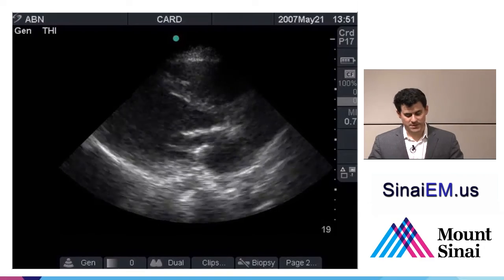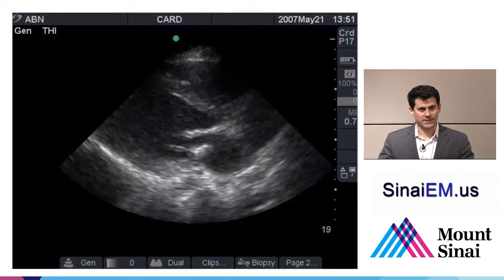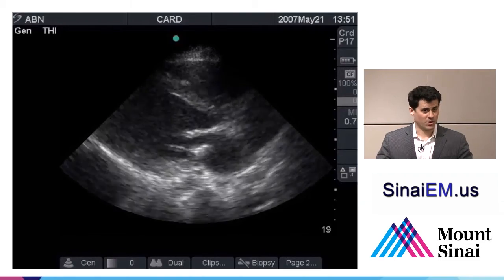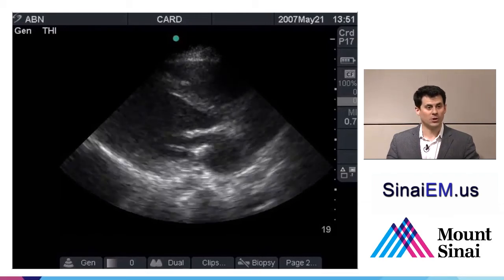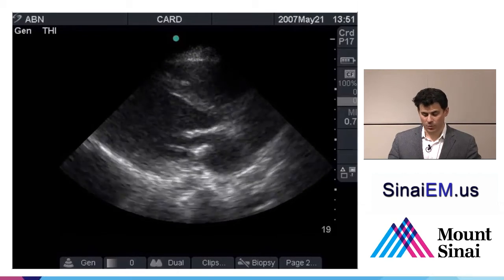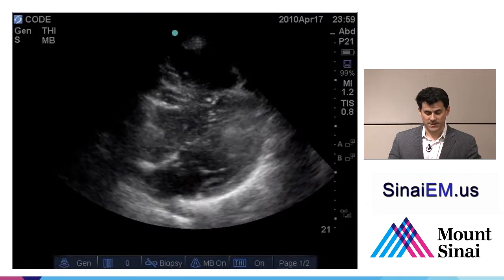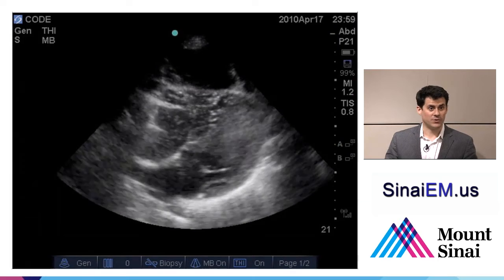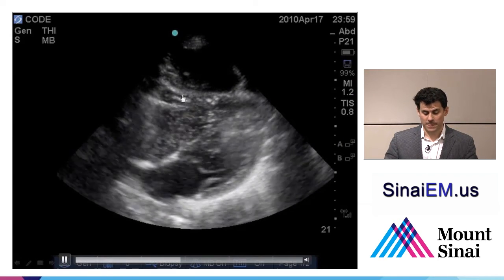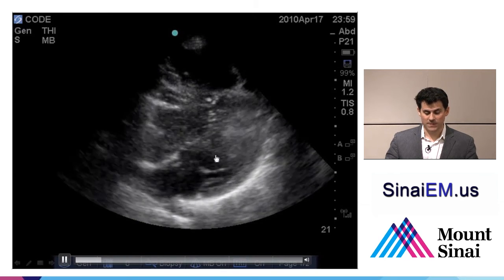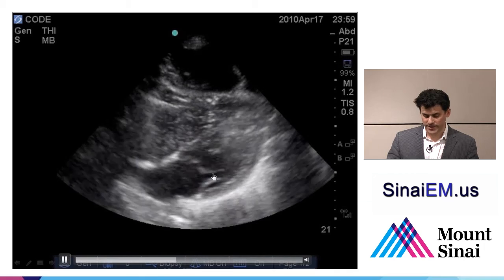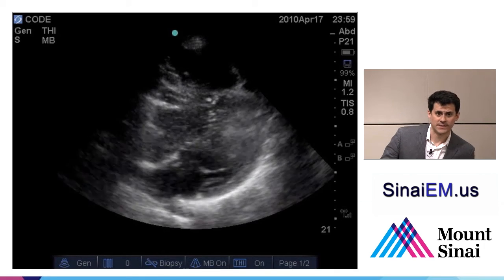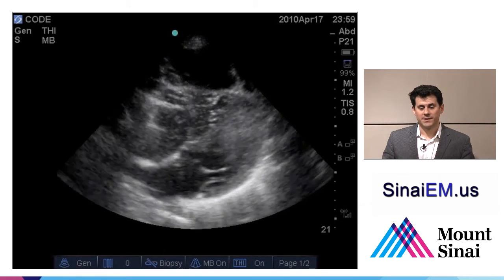In a sub-xiphoid view taken during a pulse check of an arrest, the probe is ready while chest compressions occur — we don't want to interrupt compressions. During the pulse check and rhythm check, the ultrasound probe is applied and we see no cardiac contractility, no movement of the walls together, no thickening, a cardiac standstill — and this has an incredibly poor prognosis. In another example, we see the right ventricle anteriorly, the left ventricle below, and a swirl of clotted blood or air bubbles within the chambers, again demonstrating no cardiac contractility. Most literature suggests that pulselessness with lack of cardiac contractility is essentially not a survivable event.